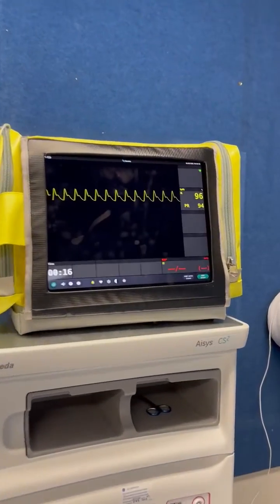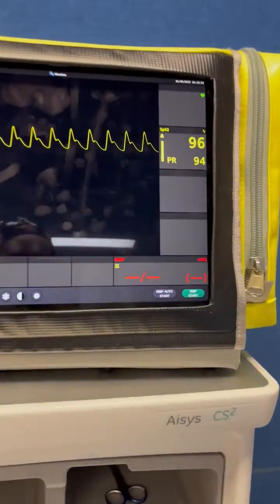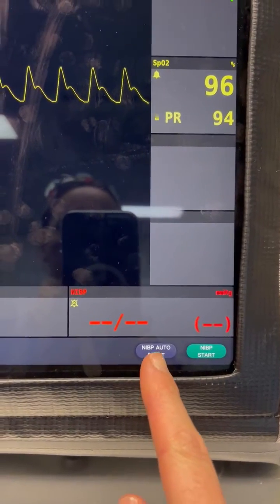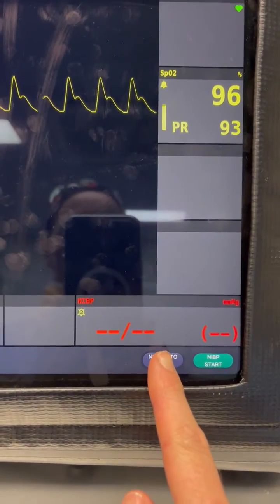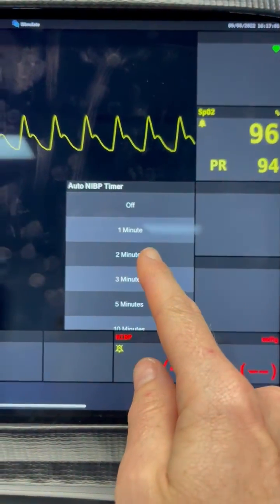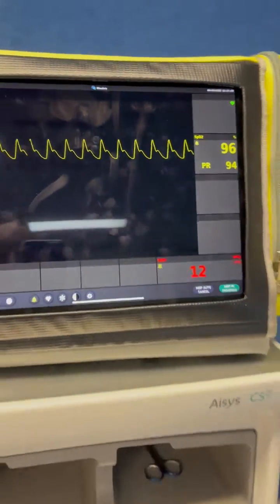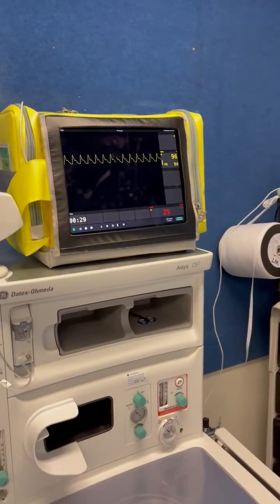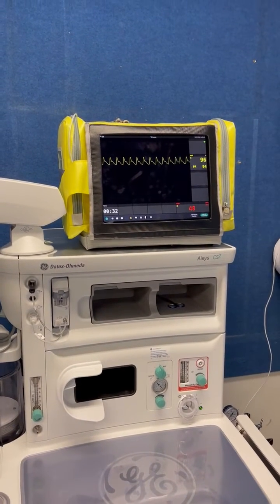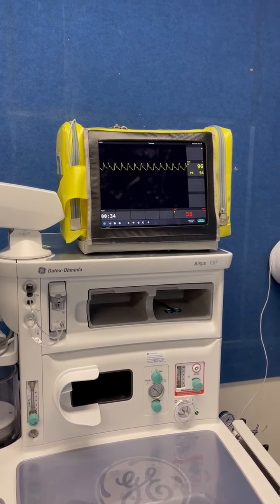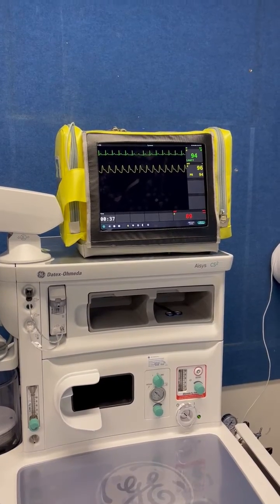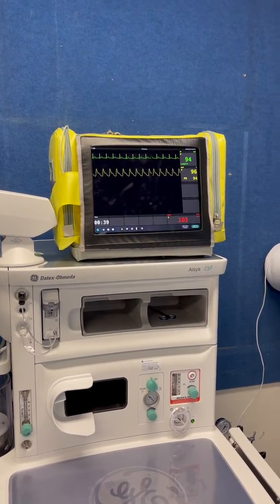I'm just going to zoom in close here. If you see here, there's a button — NIBP auto start. When you push that, select two minutes and it will start the reading for you.